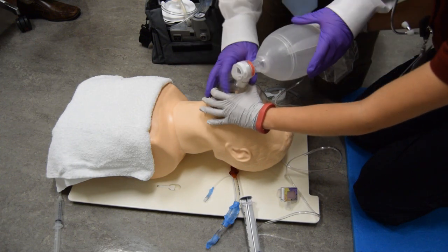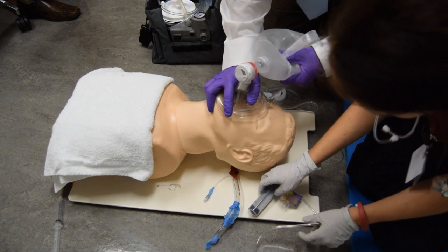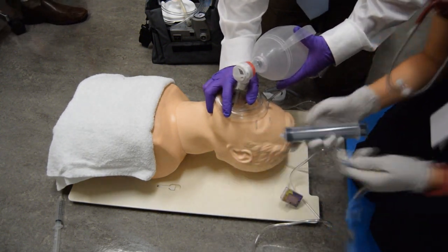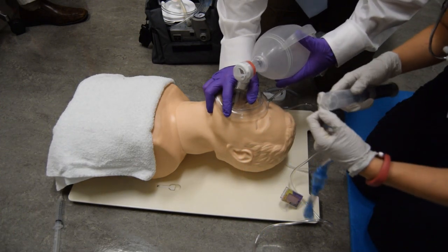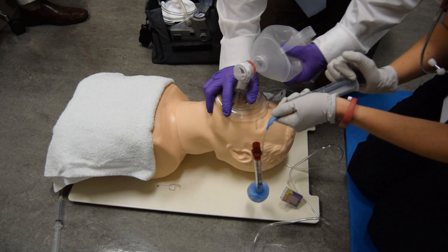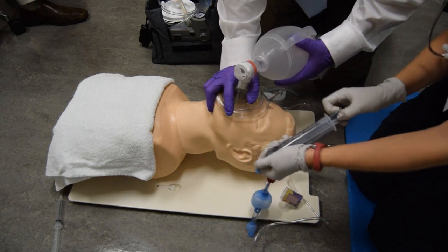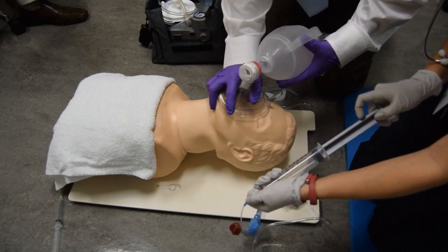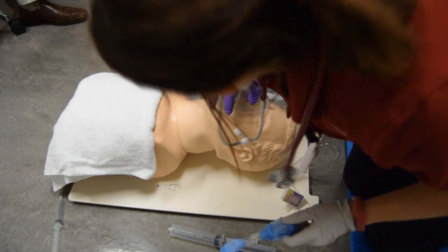Can you pre-oxygenate the patient please? Checks and prepares supraglottic airway device. Checking for leaks — no leaks. Lubricates distal tip of the device.